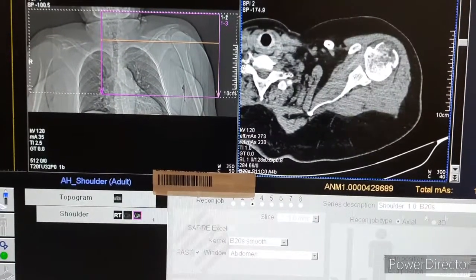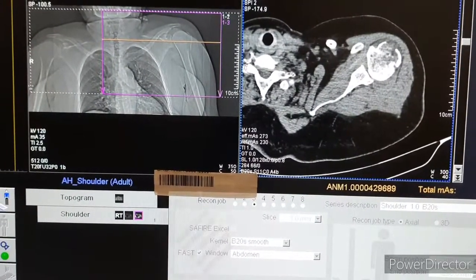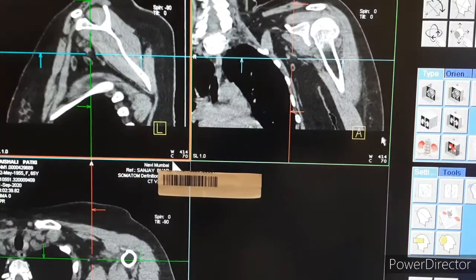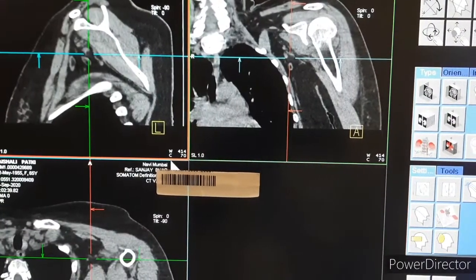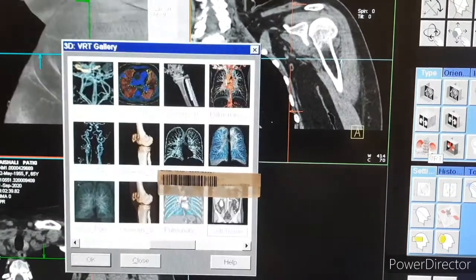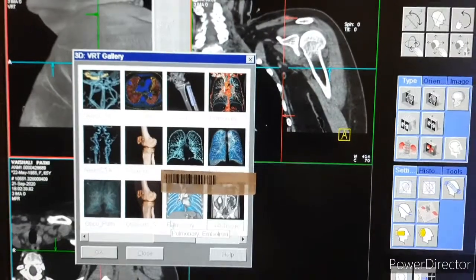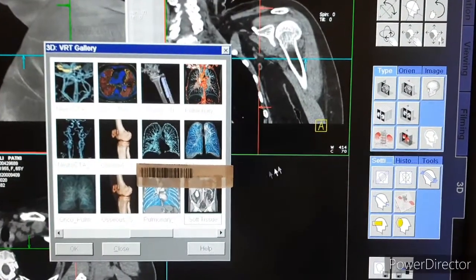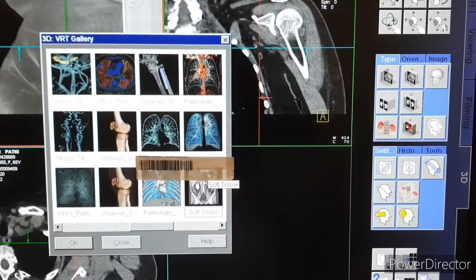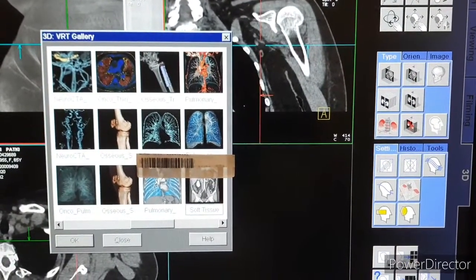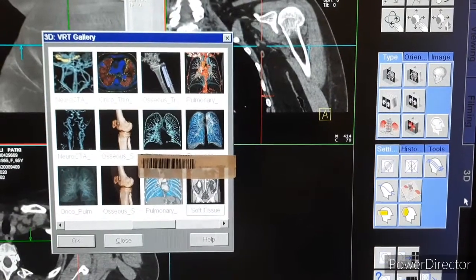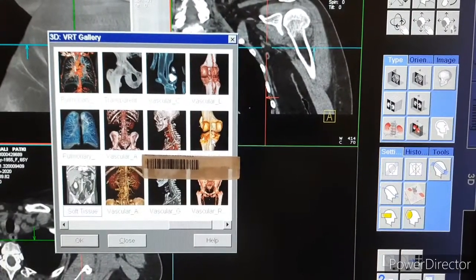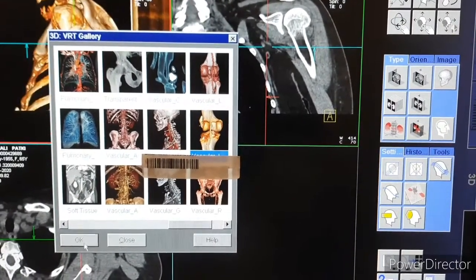Now we will see the processing of the shoulder joint. Load the soft tissue series onto the 3D workstation and choose your preset accordingly for the shoulder joint.